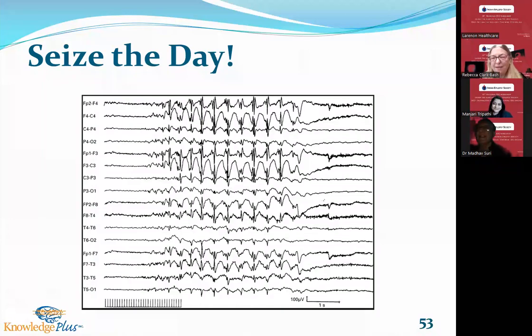Yeah. So we're going to look at what we saw in our pediatric population, in our adult population. We saw theta range and delta range in that seven-year-old. So is that abnormal? It's not abnormal unless it extends beyond that 60 seconds, that 1 minute. Once it's still continuing, we have to look for the source of that.